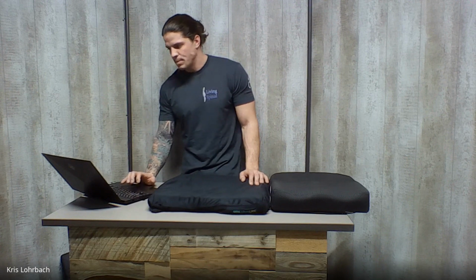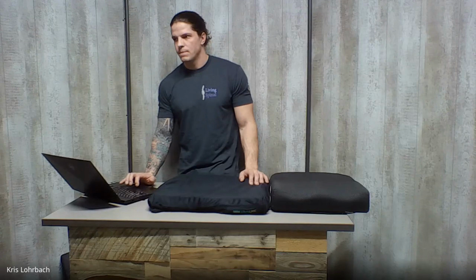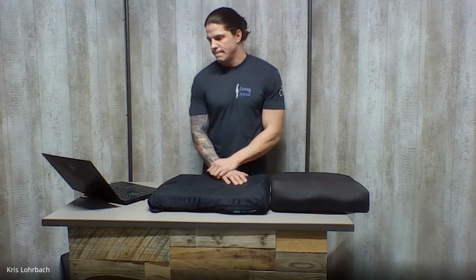Yeah. But if the cushion goes up, the footrest goes up, and the backrest goes up, and then they're positioned the same. Yeah. And also there's armrests. Armrests may have to go up or down too. And then also it does affect other things too. Like it affects how they reach their handrims and push their handrims. Even if it does so marginally, for some people that's important.